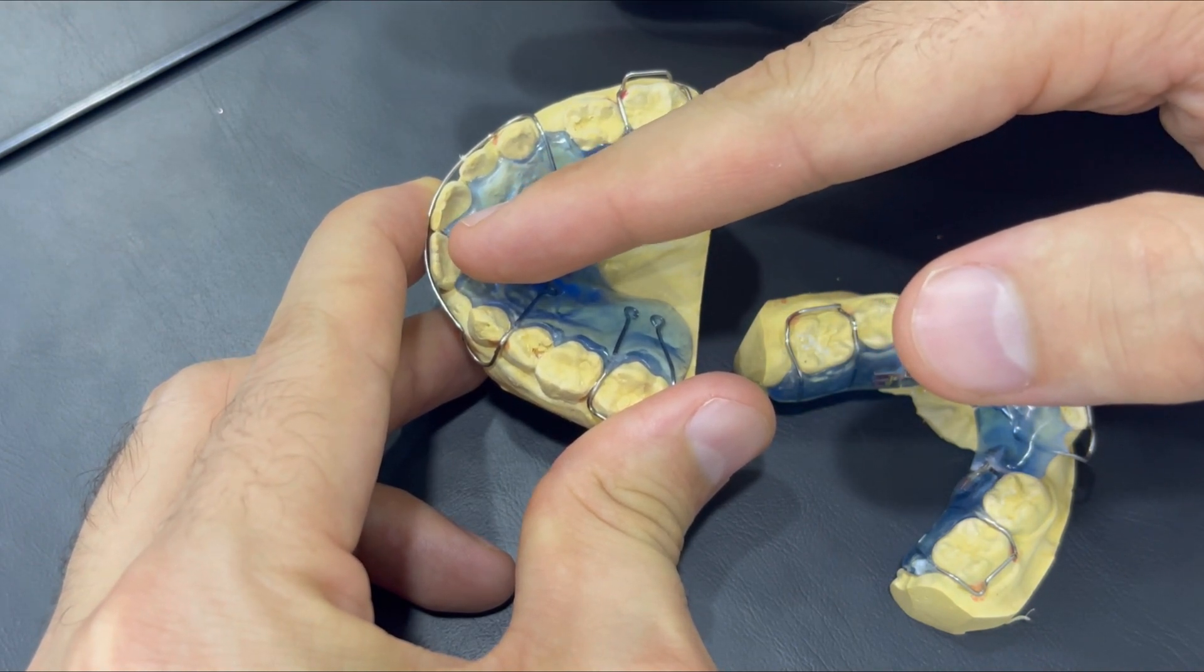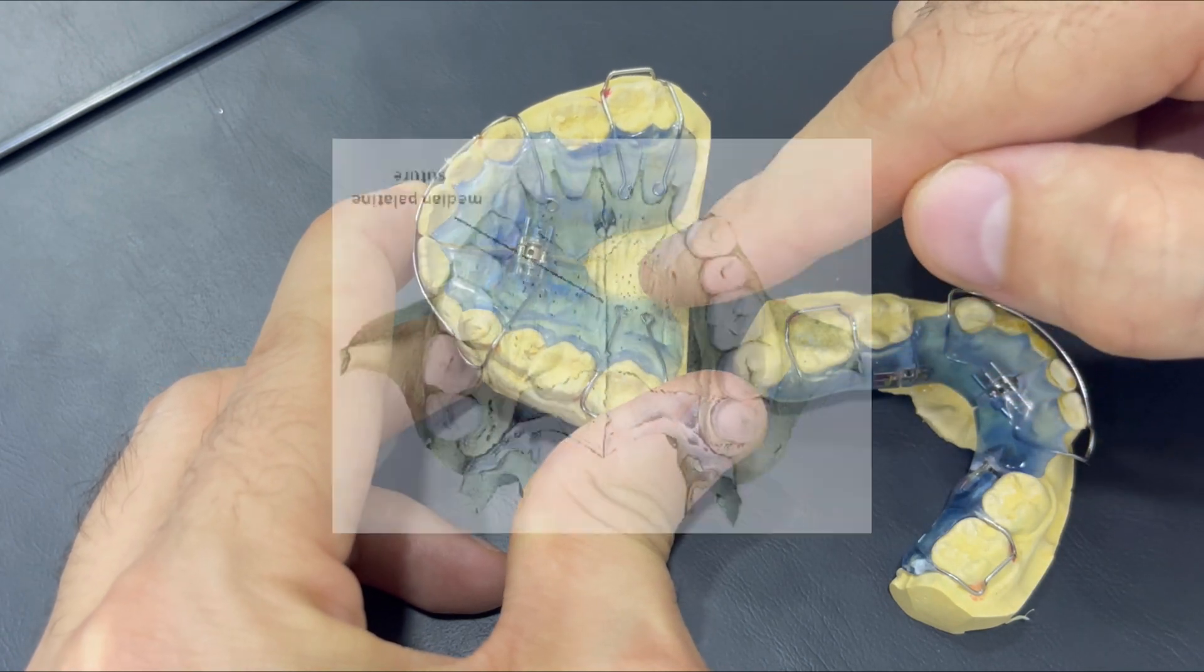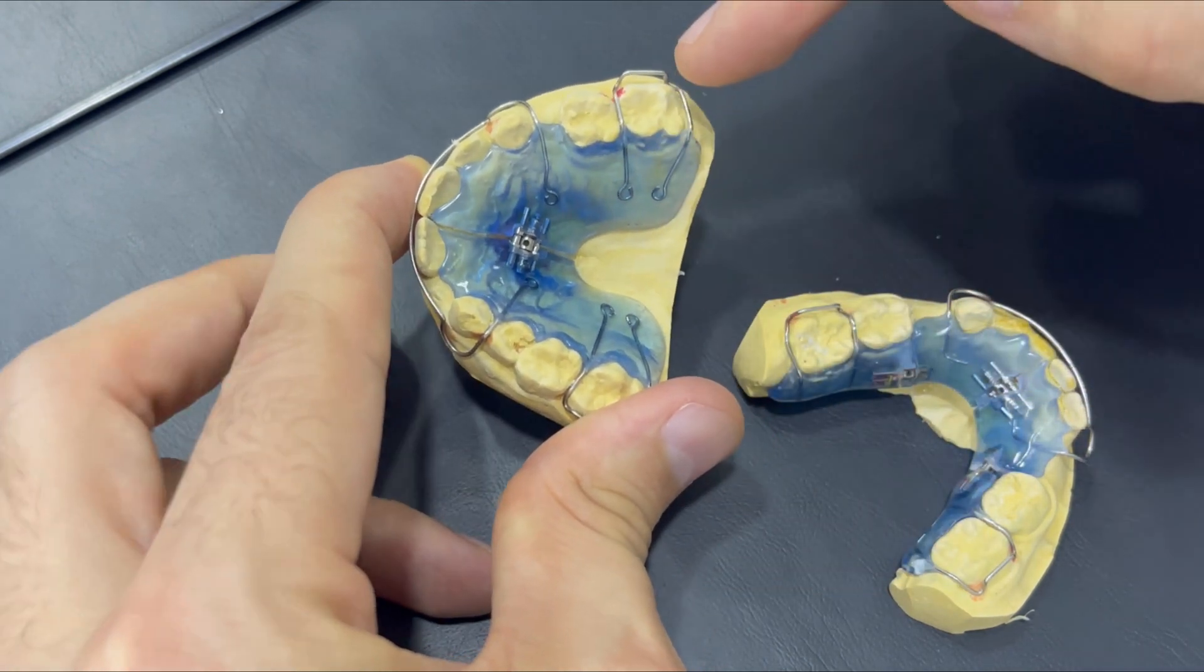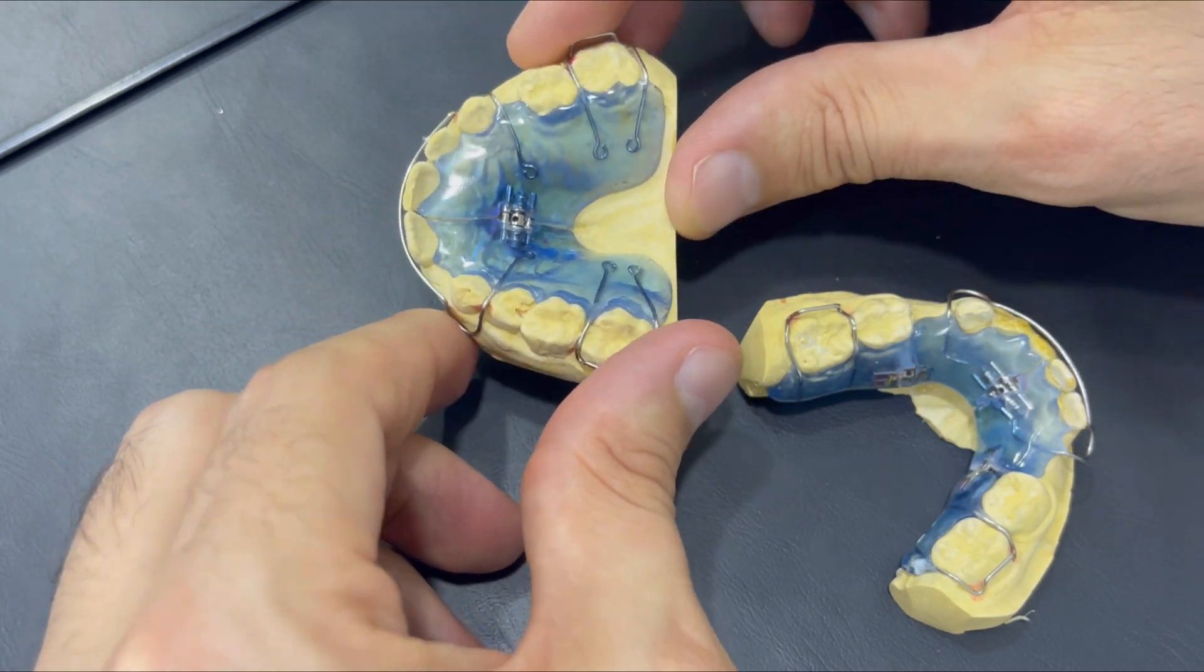And splitting the maxilla, the two halves of the maxilla in the palatal suture which is passing here in this line. And we could see diastema in the middle, or the space between the central teeth, which is a good sign of the successful expansion.